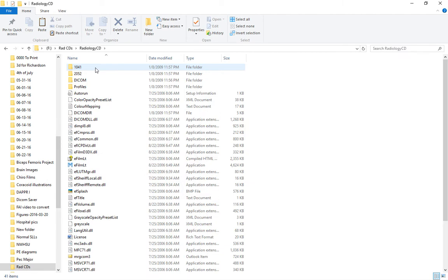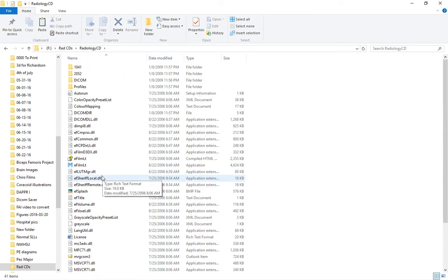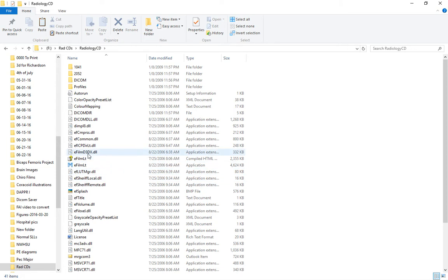The first one we open shows a whole lot of files, which is a typical scenario. There's a bunch of files for the built-in viewer on the CD and then a bunch of different folders.